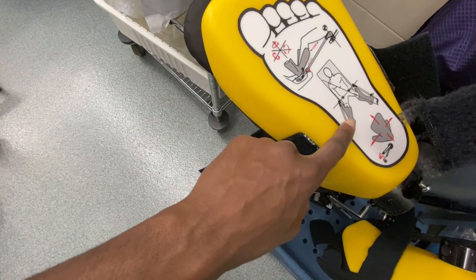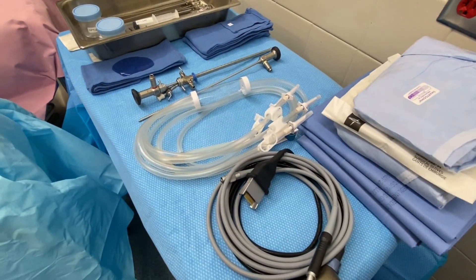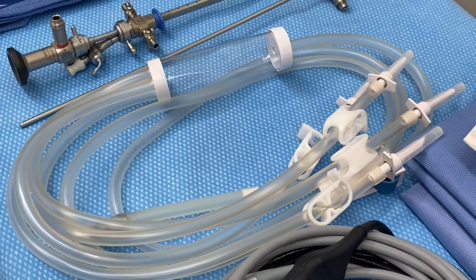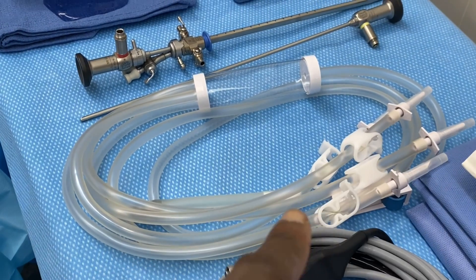Here we have our cysto tubing. Unfortunately we don't have the cysto tubing with two spikes — we ran out and are waiting on another supply — so we have to use the one with four spikes.